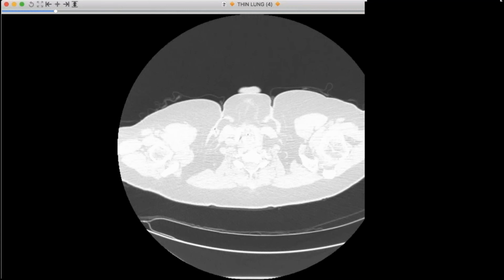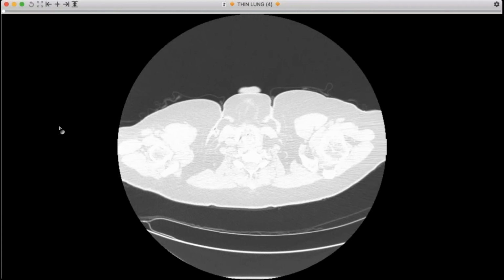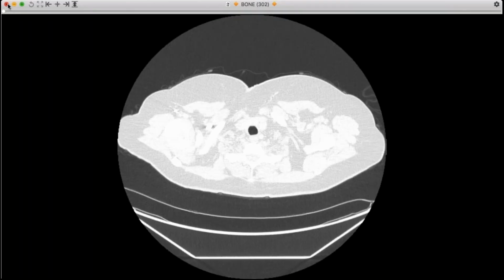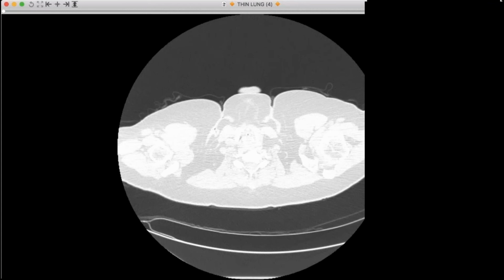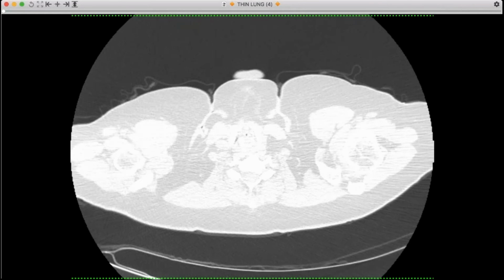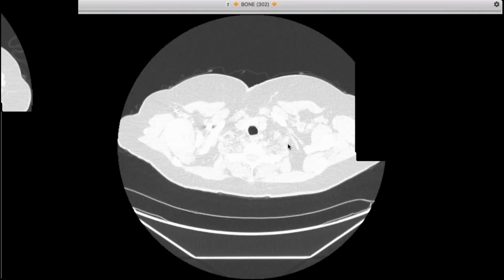Okay. And then the last case is not a vascular case. Let me pull it up here and get them in the right order, and I'll show them. So this is a patient with metastatic melanoma, and I'll get the images up in a second, who's being treated with nivolumab. And I know I've seen some nivolumab cases before, and then I got to show you this image. All right, there we go.